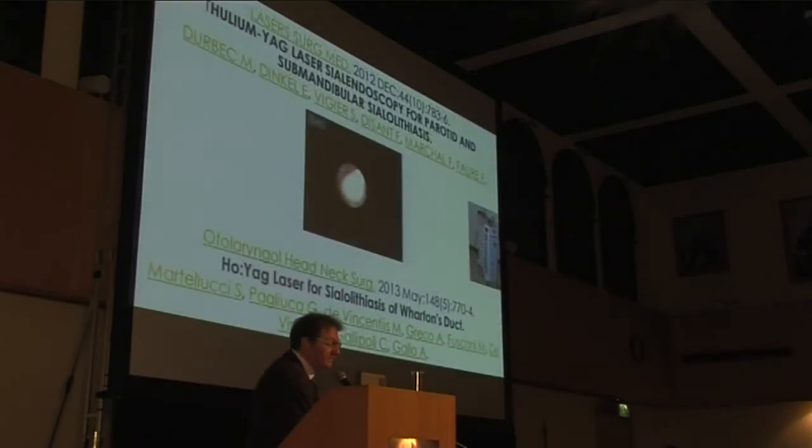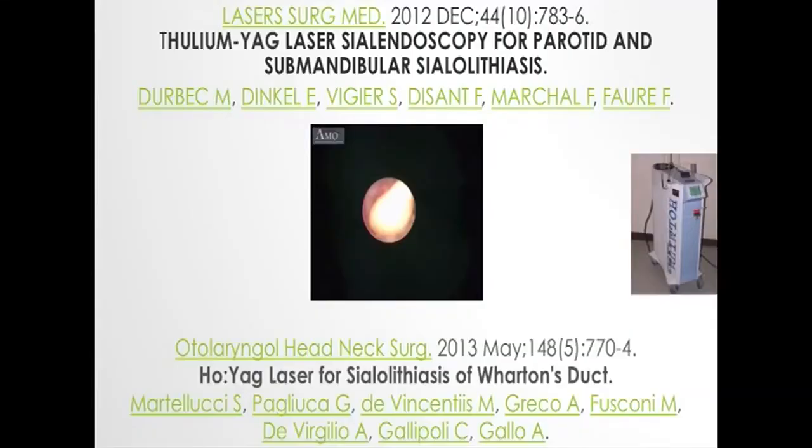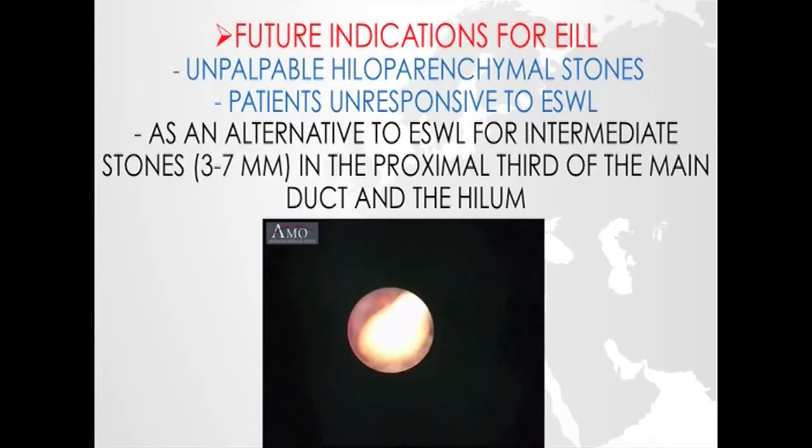Especially because now we have some data concerning the use of laser — one from the French group with Thulium YAG laser and the second from an Italian group that used a Holmium YAG laser like in my experience. These can be considered future indications for endoscopic laser lithotripsy: unpalpable hiloparenchymal stones, patients unresponsive to extracorporeal shockwave lithotripsy, and as an alternative to extracorporeal shockwave lithotripsy for intermediate stones in the proximal third of the main duct and the hilum.